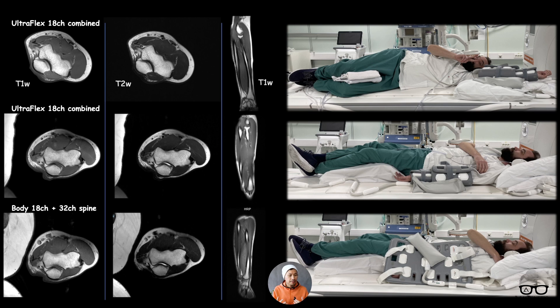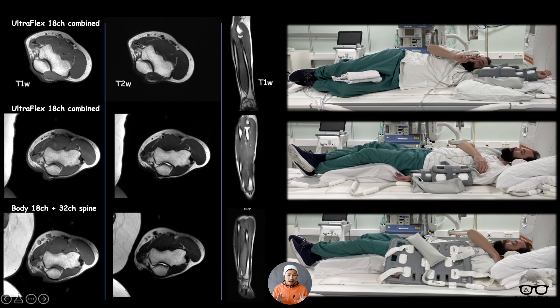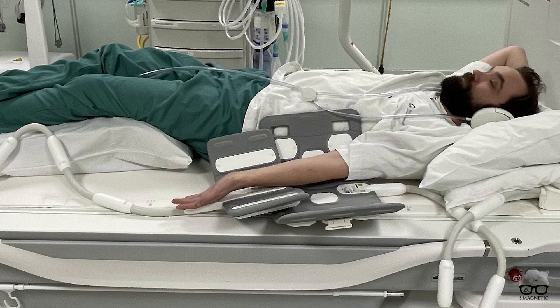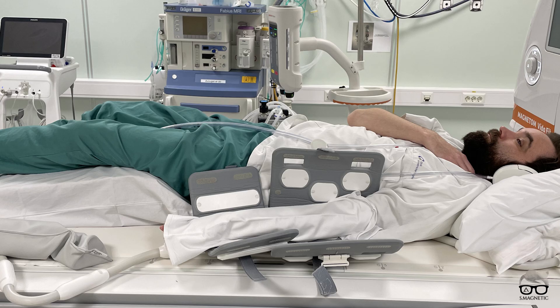With the arm downwards position, it's a little more challenging — you have a lot of anatomy around you and you need to avoid fold-over artifacts. The scan time can be a little longer because you need to use phase oversampling or shift the phase encoding direction, but the image quality is good.